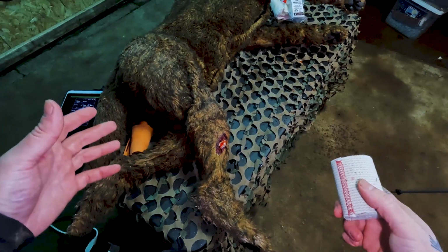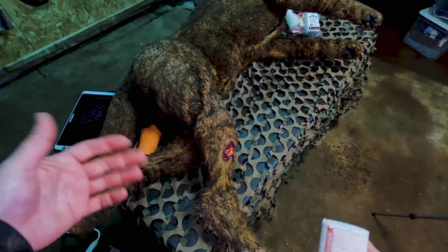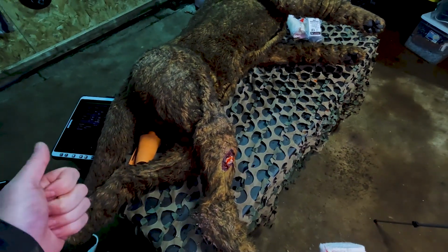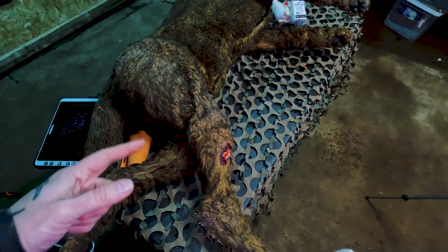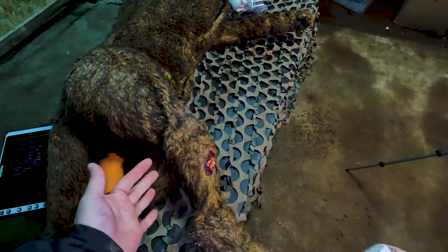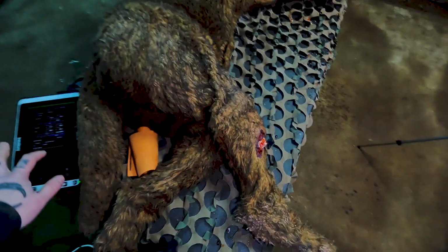First thing that we'll go over is any kind of massive hemorrhage where it might be more appropriate to place a tourniquet than trying to do a pressure dressing or pack the wound. So here's a rear leg, which could have a major arterial bleed and having an open compound fracture, whether that's a partial or full traumatic amputation.